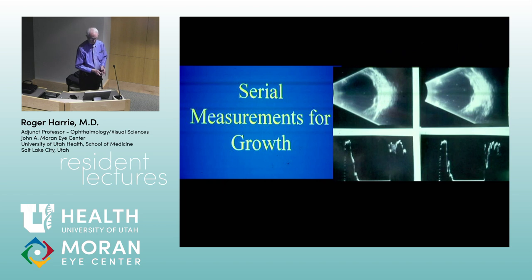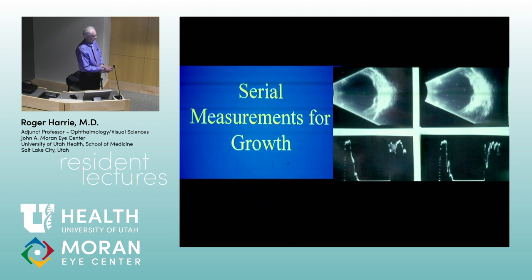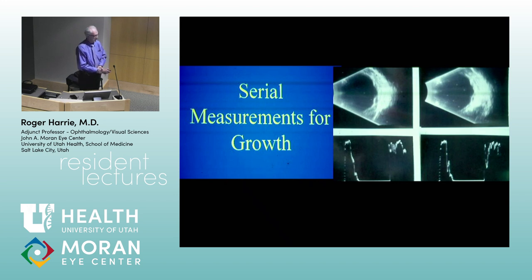For measuring and following tumors: here's a small melanoma, and a year later it looked kind of the same on B-scan with only slight thickness change. But a big difference was the reflectivity pattern — initially kind of high, like a nevus, then getting lower and more regular over time. That change in reflectivity represents conversion from nevus to melanoma. That's why we do ultrasound on nevi — to get baseline measurements and follow over time to see if they're changing.